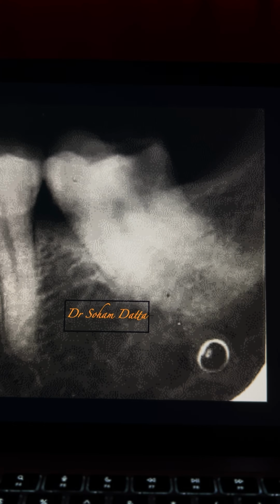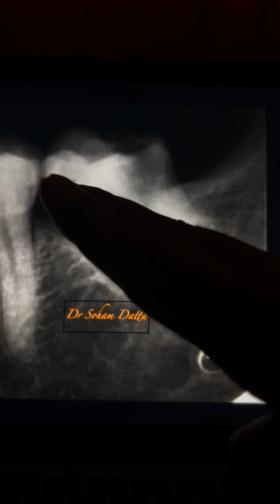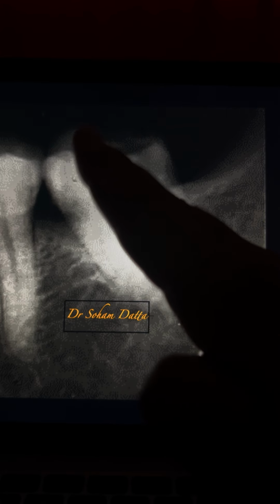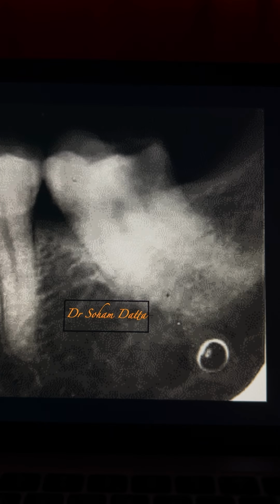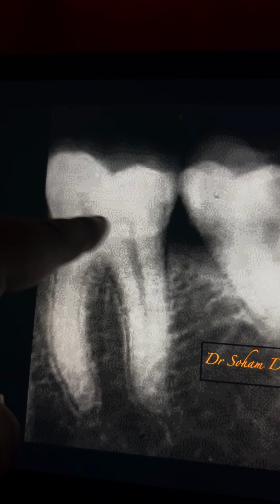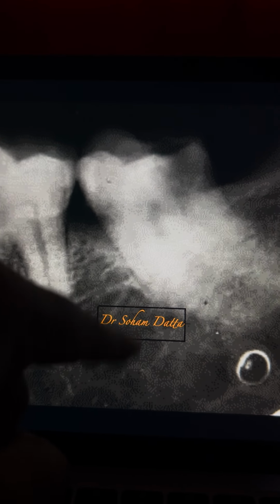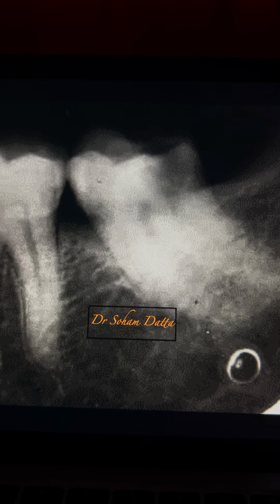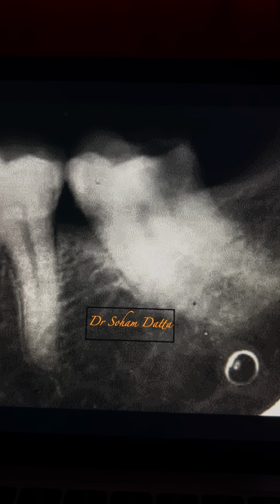Now before elaborating the case, you can see at a glance the excessive mesial tilt of this molar. Now it is not a 7, because this one is a 6. This is the 6. The 7 was already extracted long way back by a dentist.